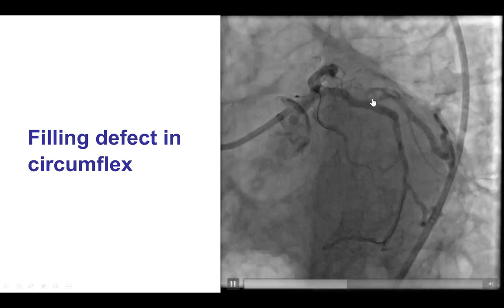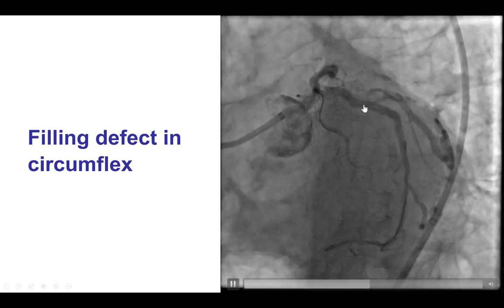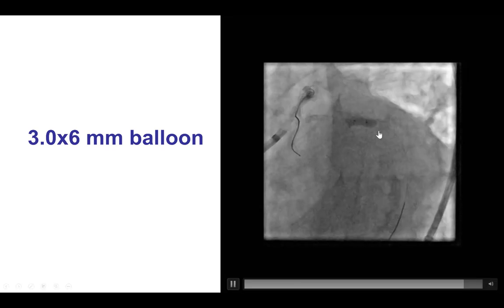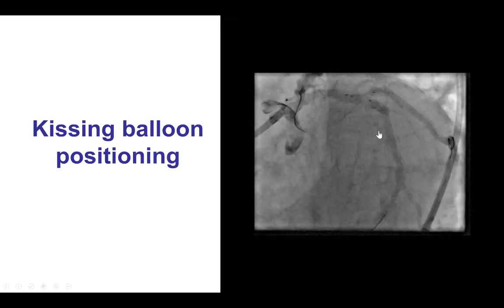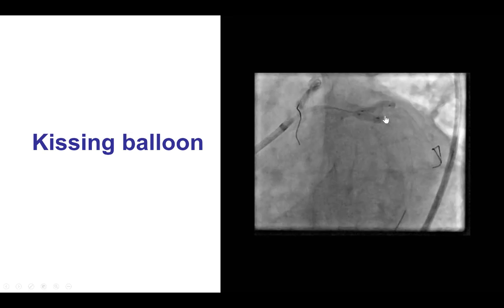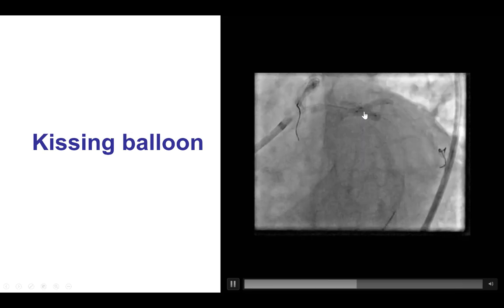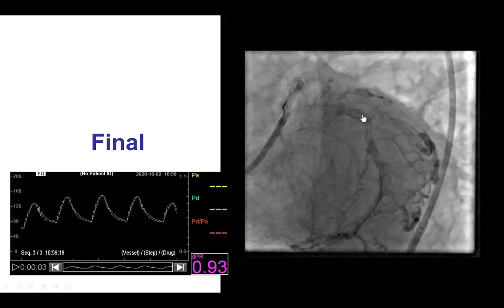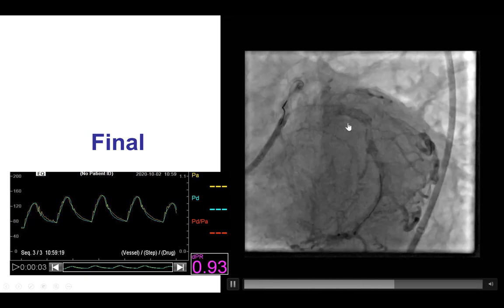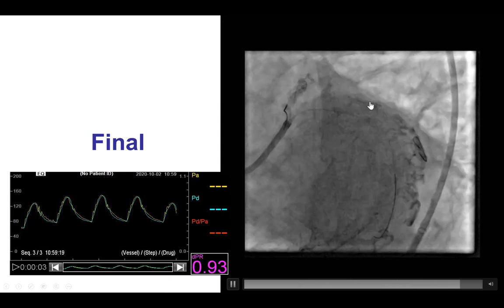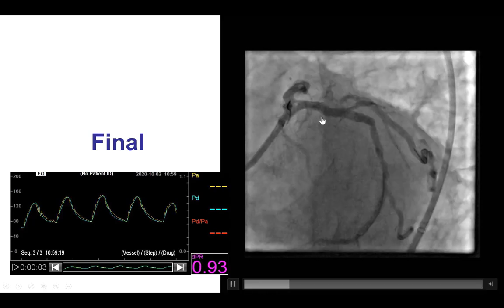The result in the circumflex also did not look great — there seemed to be a filling defect, making us wonder whether we deformed the stent by trying to advance the pressure wire and balloon. We post-dilated with a 3.0 mm balloon, but it still did not look great. We then performed a kissing balloon inflation, placing a balloon into the OM as well as into the circumflex. The stent proximal segment was relatively short, but we were still able to get the two balloons protruding partially from the side branch back into the main vessel. After kissing balloon inflation and proximal optimization with a 3.0 by 6 mm balloon, repeat pressure wire measurement showed a DPR of 0.93 — no longer ischemic — and the case was stopped.